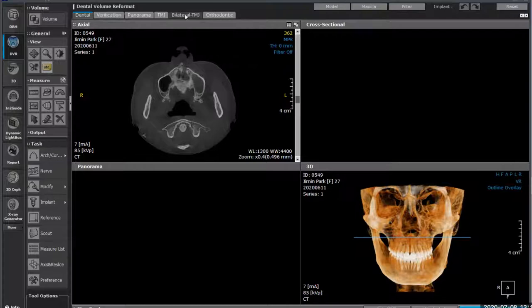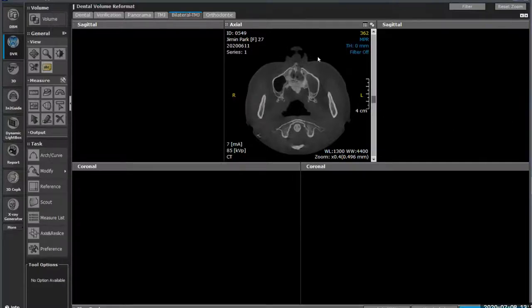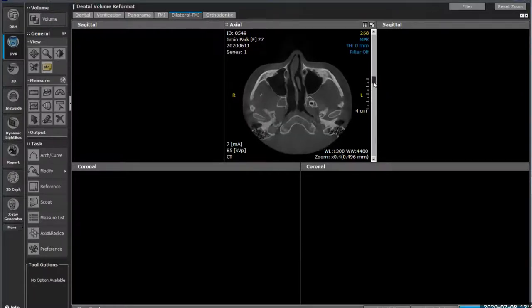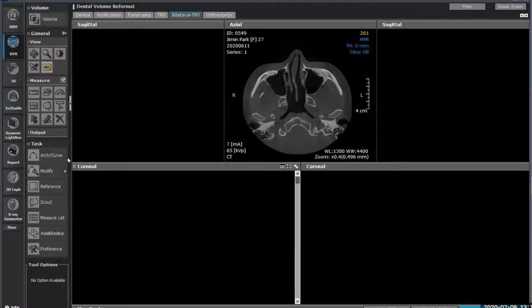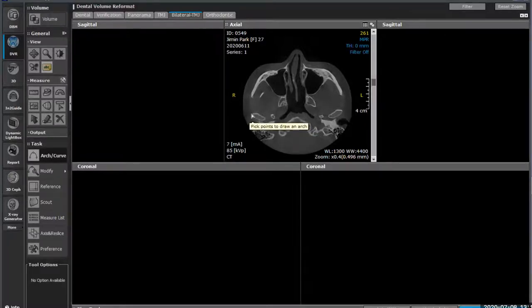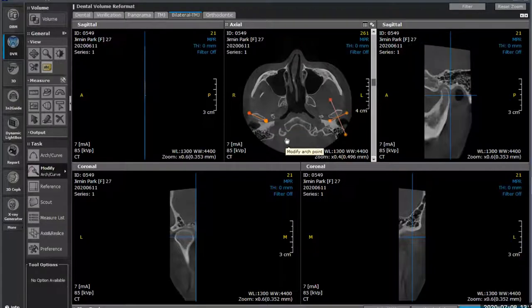Looking at Bilateral TMJ, this gives us the ability to create right and left views in the sagittal and coronal planes. In the center view we move up to the TMJ itself - there are our condyles. We're going to go to Arch Curve and plot a point across the condyles, then double-click to finish. Now we're able to break this apart and take a look at it.